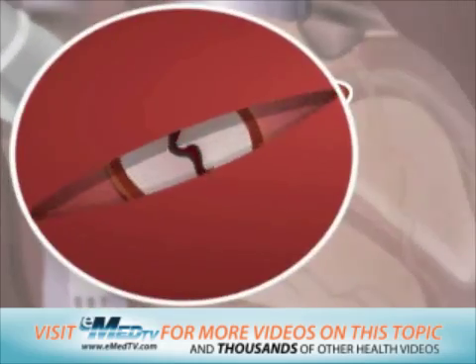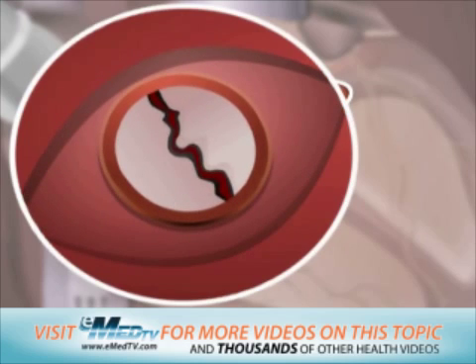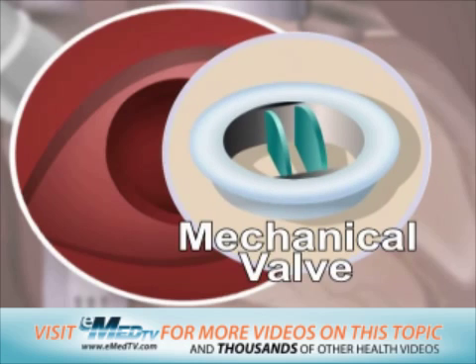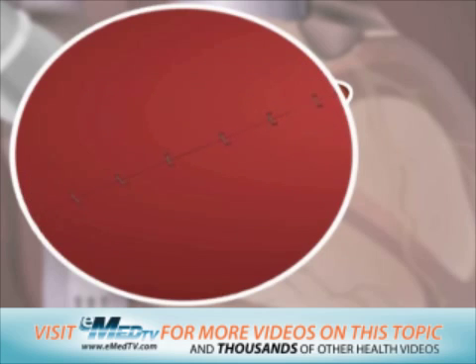The atrium is gently opened to reveal the mitral valve. The surgeon will then carefully remove the old mitral valve. At this time, the doctor will select a mechanical or tissue replacement valve and will sew this into place with stitches. Once securely in place, the atrium will be closed with stitches.